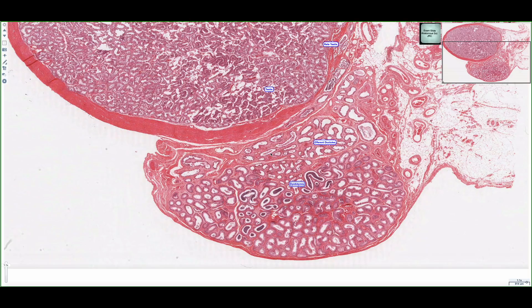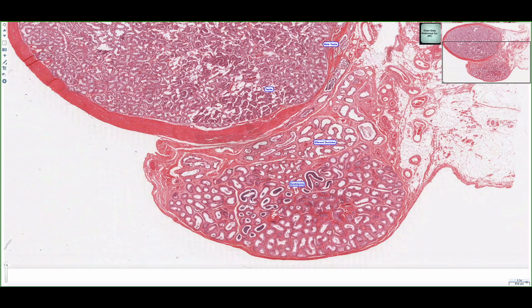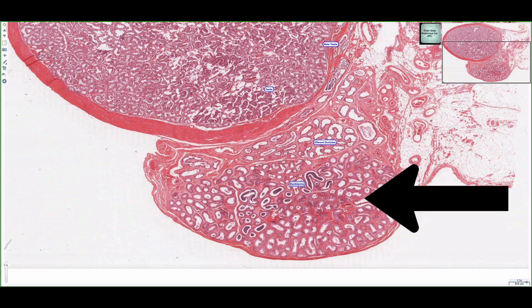This slide depicts two important regions essential for carrying the developing spermatozoa from the rete testis region towards the ductus deferens. These two regions are the efferent ductules, which can be seen outlined here, and the epididymis, which can be found down in this region.